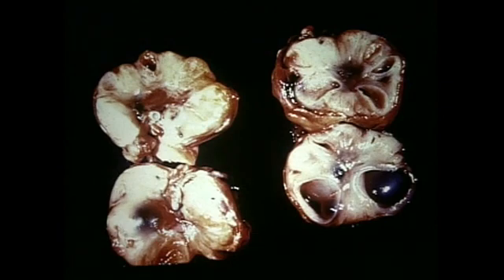A well-functioning tertiary or Graafian follicle should not be confused with a cystic follicle. And then lastly, the texture of the equine ovary is very firm and is composed of fibroblasts that, if one does not know about the structure of this type of architecture, one can fall into the trap to call this a fibroma or a fibrosarcoma.